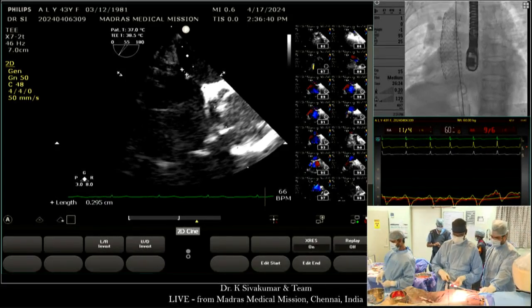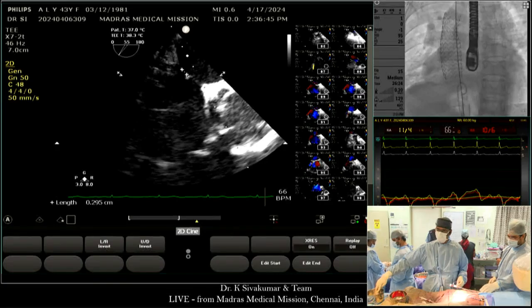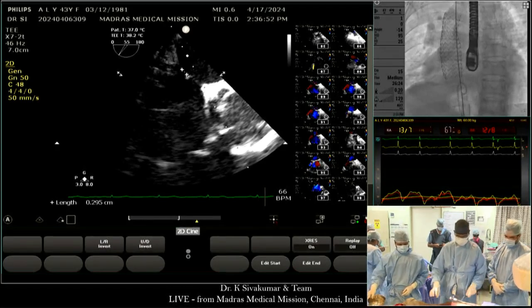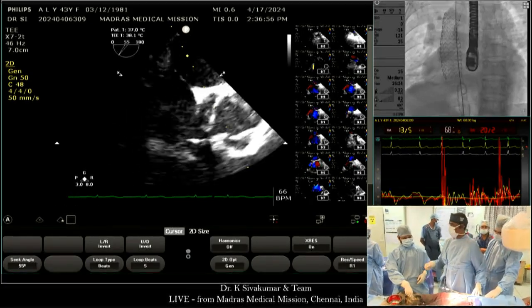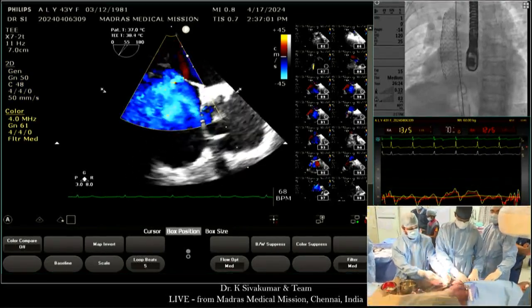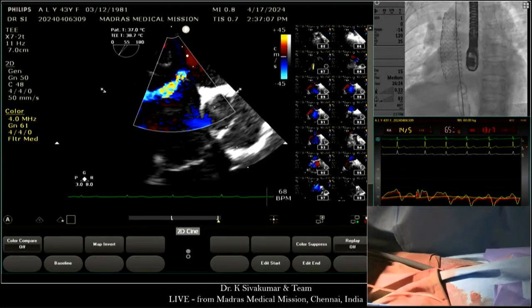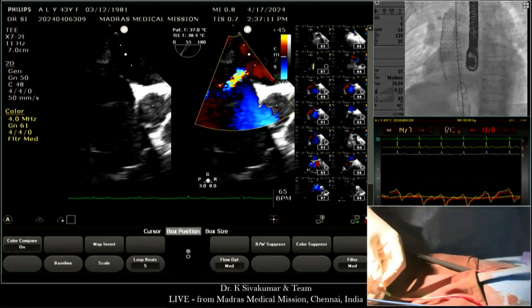This is a masterful presentation. I have two questions. One, at what point in time would you consider enlarging the sinus venosus? Do you do that based on CT or just hemodynamic measurement? And number two, if the surgeon tells you that they plan on doing something more extensive like a Warden, does that push you to consider this procedure more? Because we know the Warden long-term may not have similar outcomes like a two-patch or a single-patch technique.